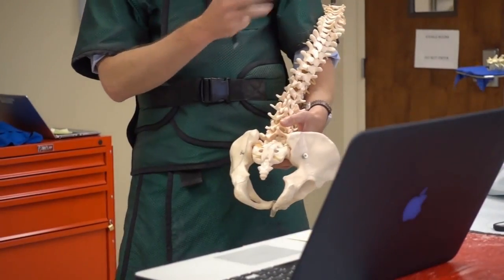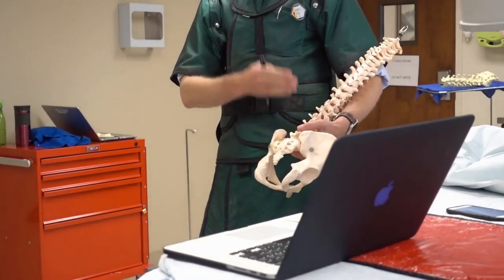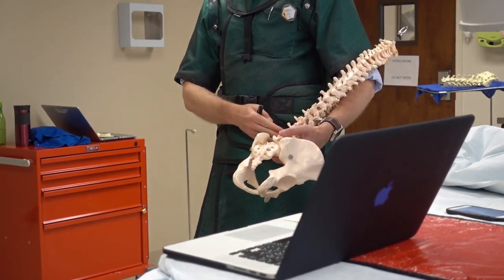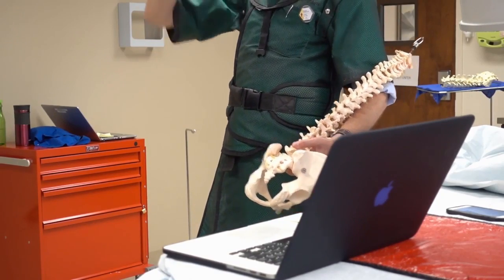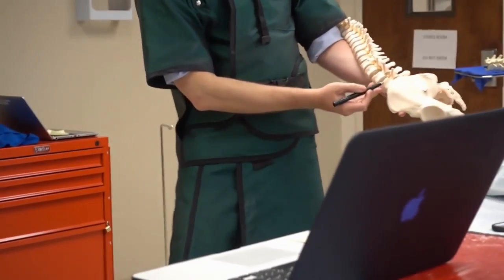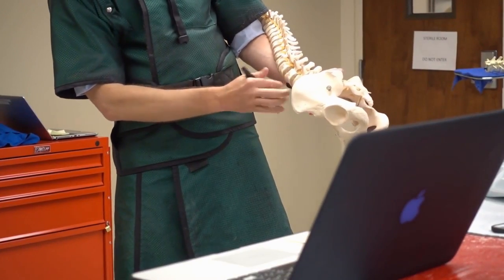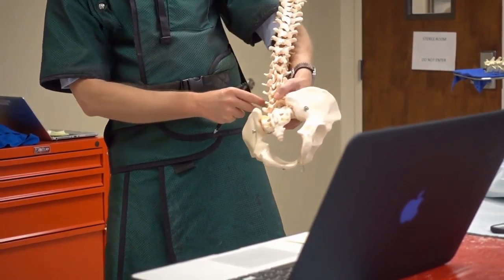But from a fluoroscopic idea, the concept is that you want to be basically just on the exact plane of the disc, okay? And if that disc is sharp, with what we call the end plates of the vertebral bodies, this is an end plate here, this is an end plate here, on top and on bottom, just before you get to the disc. If those are crisp on that segment that you want to do, then you're going to be in good stead.